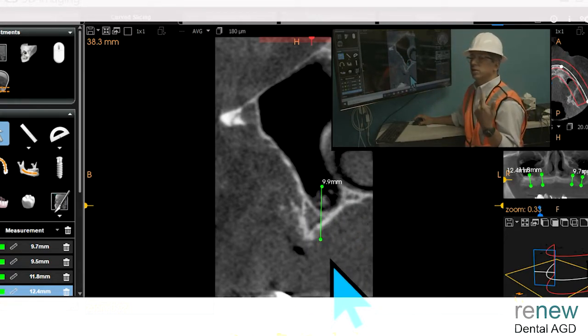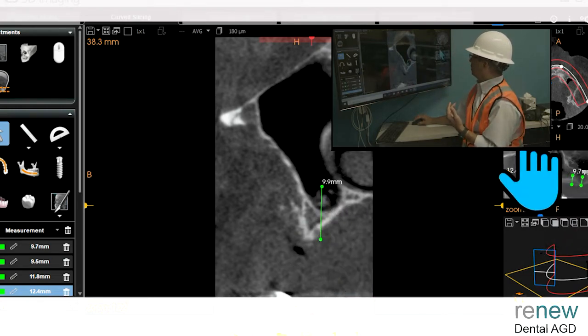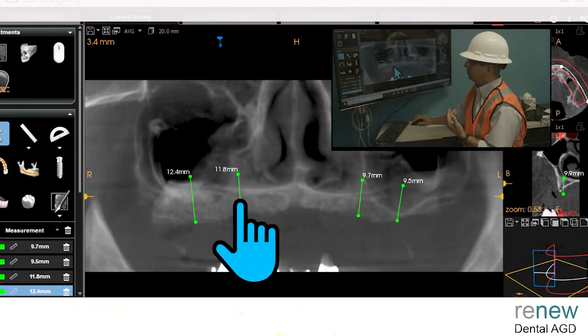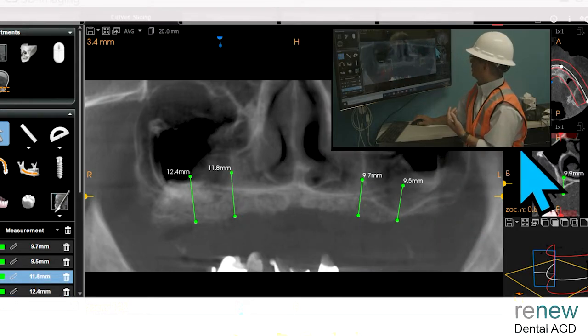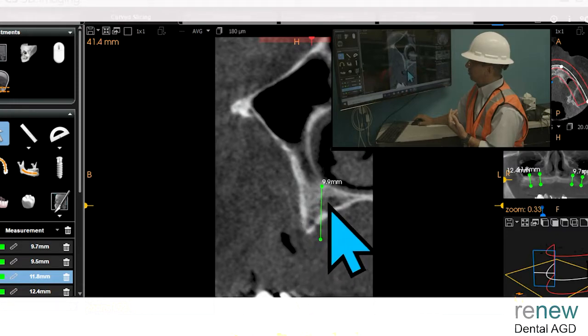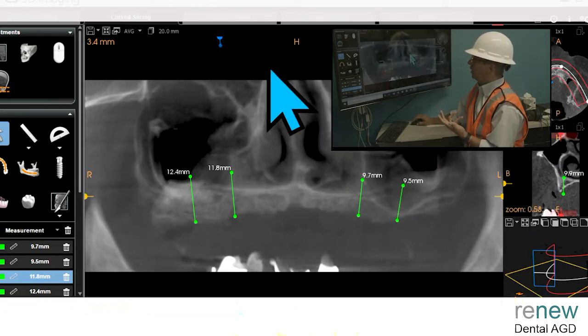The tricky part here is also the actual surgery, putting the implants in. So that's where we are here, and you're only coming closer in. This line may not be really where we want the implant, probably more like there. And that's what it looks like here. So now as we close in, you've got very, very little sinus bone, and you've got a little bit more bone here, but you've got a lot of the nasal sinus approaching here. So let's look at the upper left side.